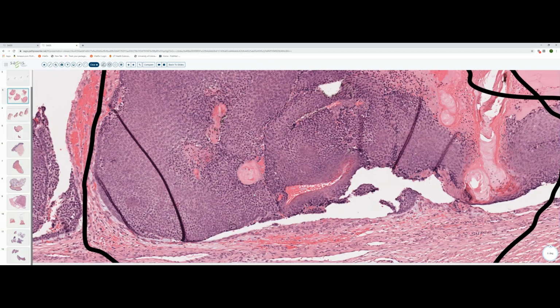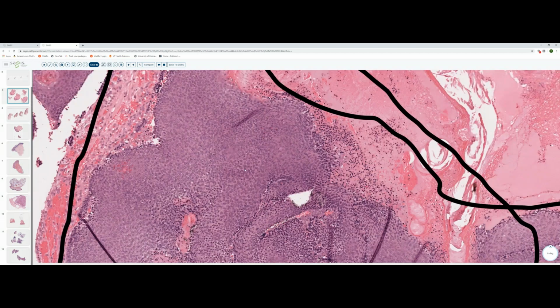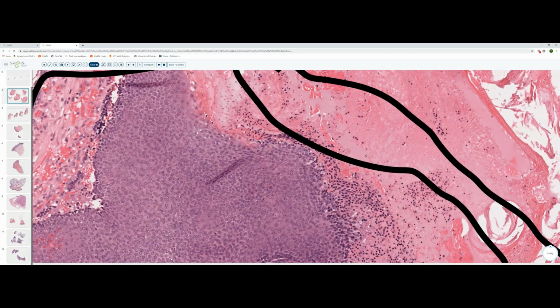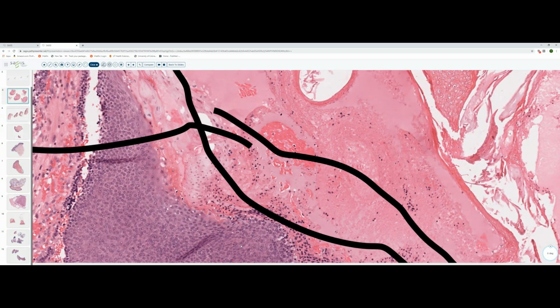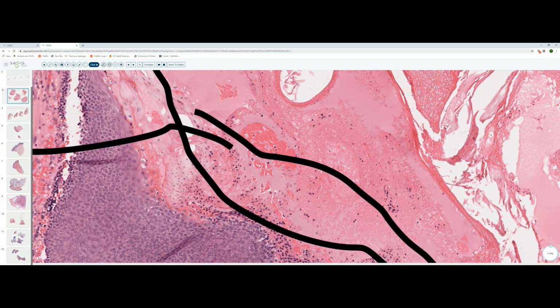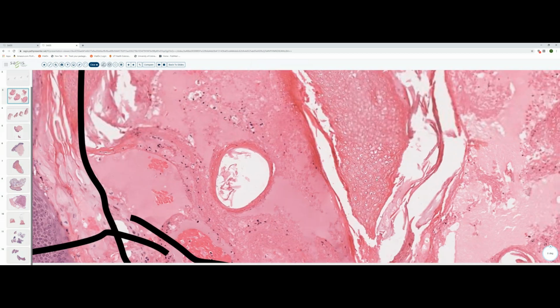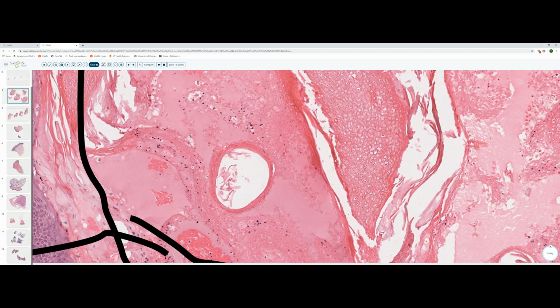Looks kind of scary. But these cells are matrical cells, hair matrix, and they're undergoing abrupt transition. Here you can see a few retained nuclei, giving rise to centrally located shadow cells. So this is like a hair matrix giving rise to hair cortex.